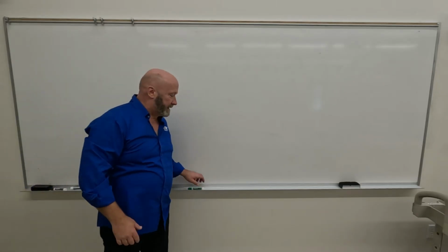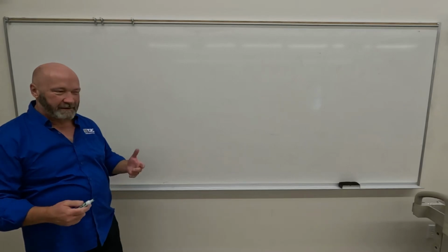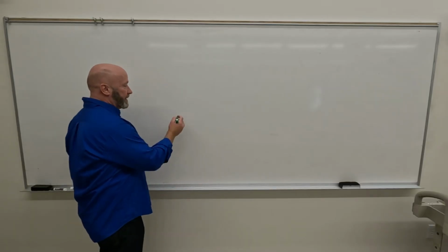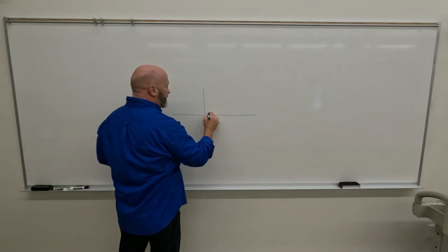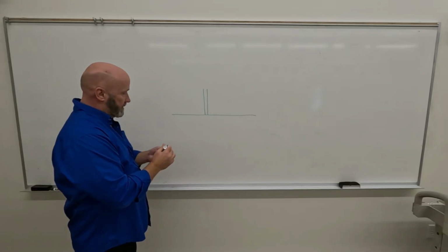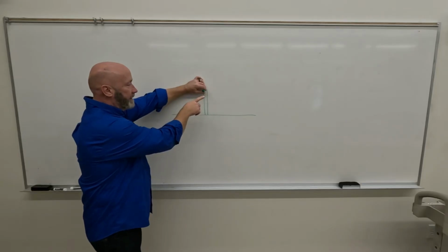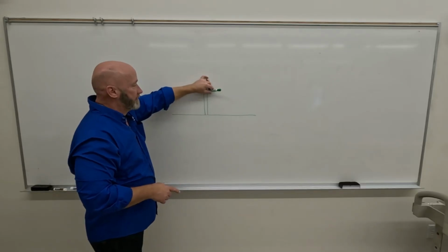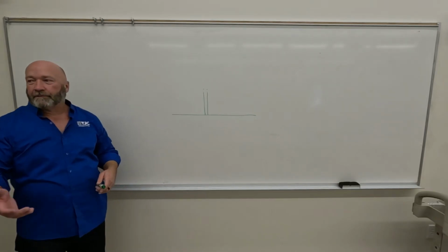So I know I'm taking these out of order according to the textbook, but one type of system that you just don't see a whole lot of, and you don't see a whole lot of those even in a doctor's office, is what we refer to as just a floor-mounted system. So a floor-mounted system, what you've got is a track, and you got this tower coming off of it, and then the x-ray, and we'll call this portion a crane, but the x-ray tube hangs off of the end of it. So you've got a little bit of motion this way, you got a little bit of motion this way, and you've got some sway so that you can position, but it's very limited.